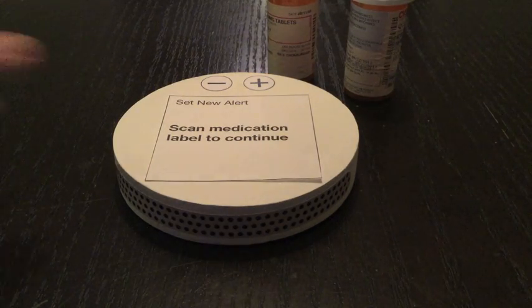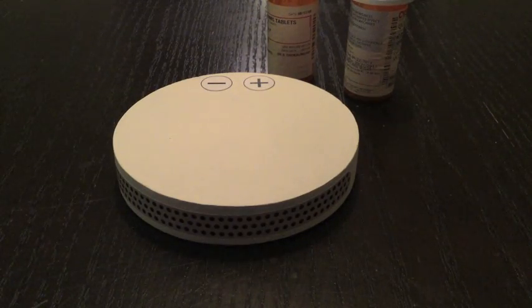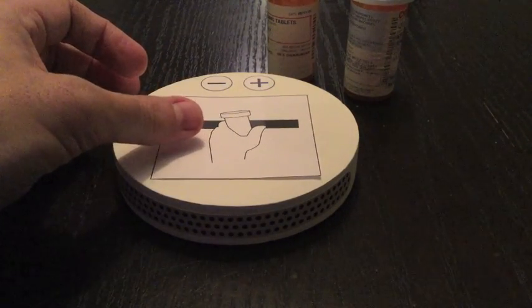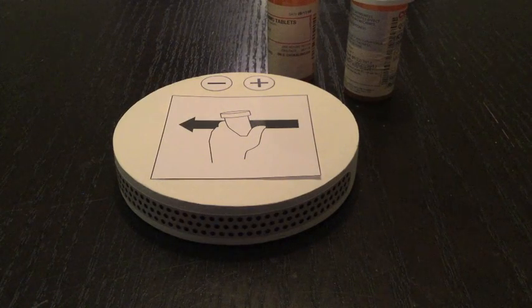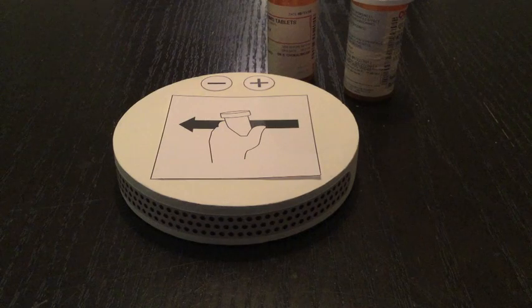After a short duration of time, a minute or two, another screen shows itself that tries to assist the user, especially if this is a first-time user, in how to scan the medication with the device. These screens may continue to revolve, where it goes back to the Set New Alert screen that reminds the user to scan medication, and then goes back to this screen that shows them how.